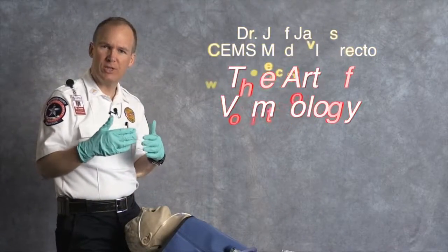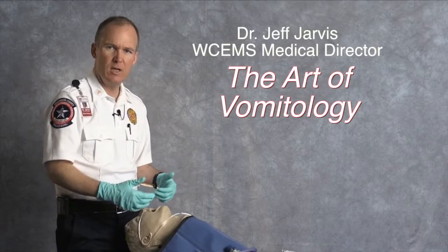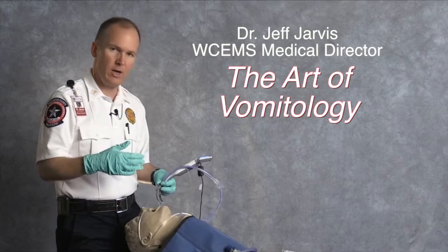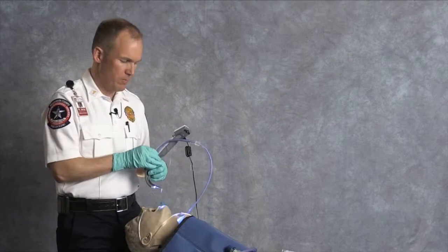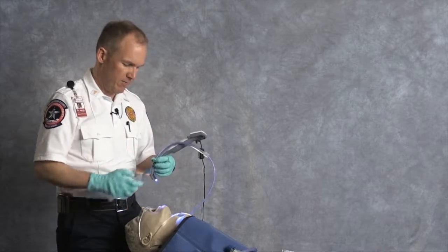We're going to skip some of the formalities, the things that are really important preceding an intubation attempt, the pre-oxygenation, the denitrogenation. We're going to skip through that and just concentrate on how to intubate with a bunch of muck in the airway. So I have my ET tube preloaded with my bougie preloaded. I have the airway already full of stuff.